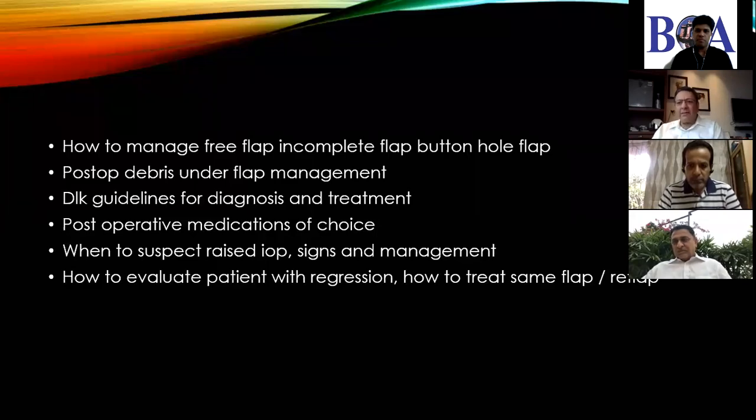In most cases, it will go back on again. But beware that in the naughty eyes, it will go right back into the same trench, so to speak, on the episclera, and you might have caused a little chemosis, and there's even more chance of you getting pseudosuction.